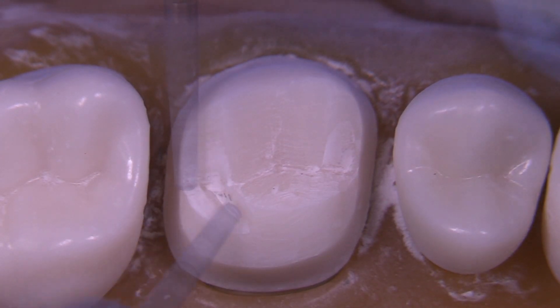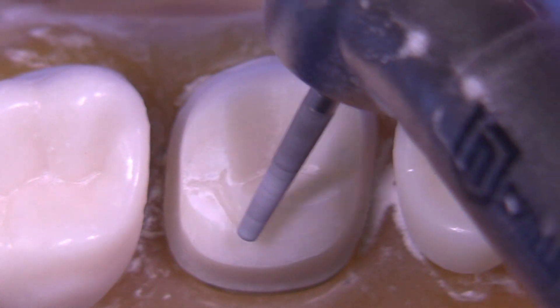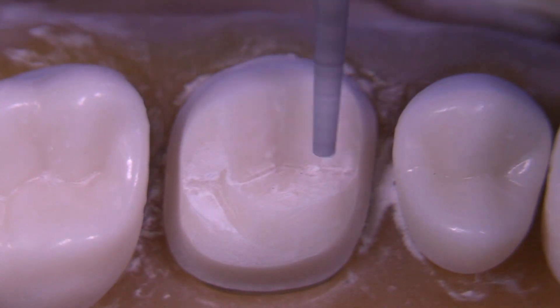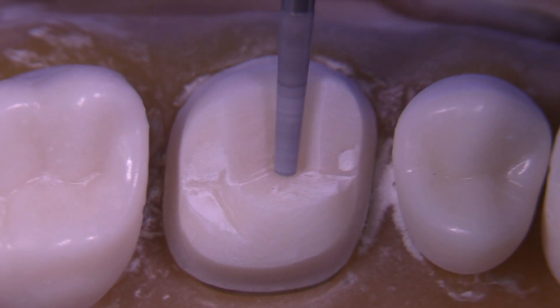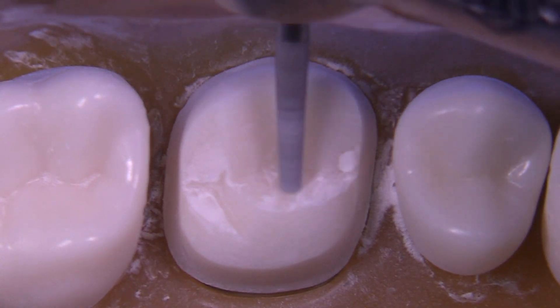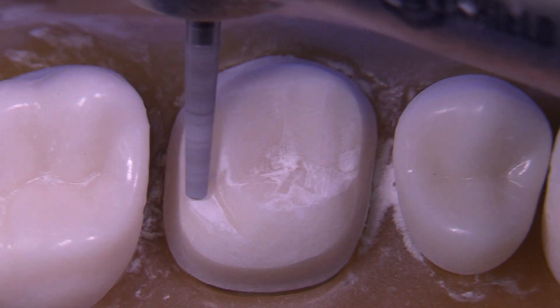The 8847-016 is a fine diamond and it has a flat end on it. It's good for shoulders but also really good to clean up occlusal reduction areas and get out that last little bit of the depth cut. Use the end of it to make the B-plane a little flatter, which gives it sort of a heart shape.